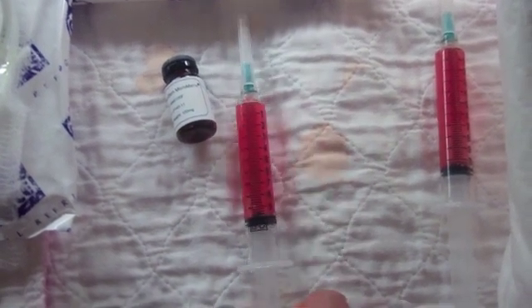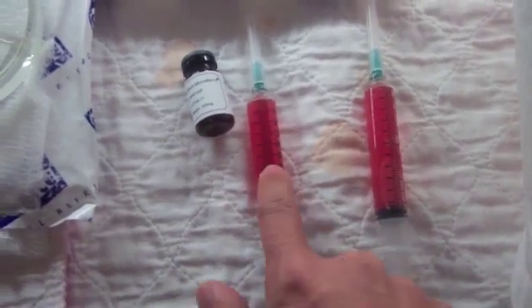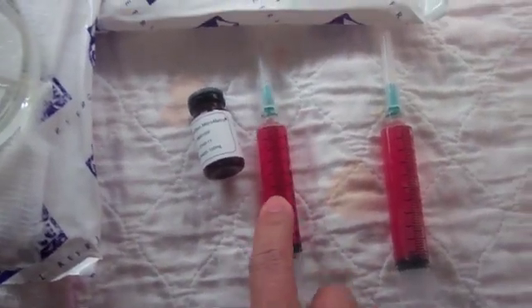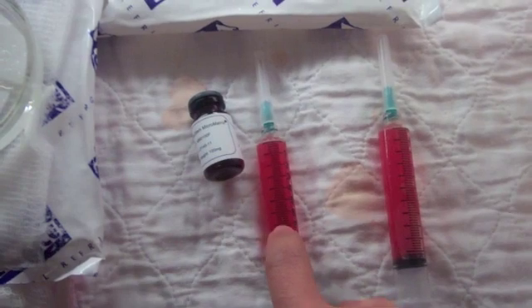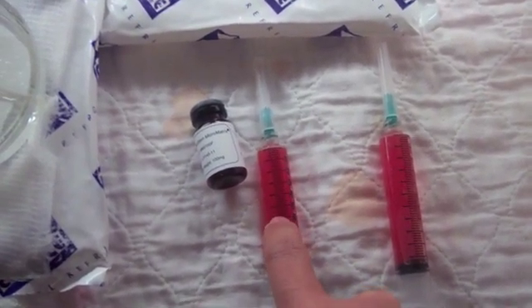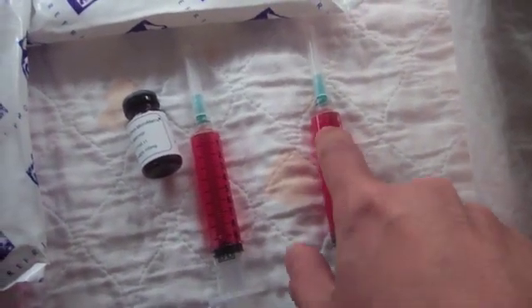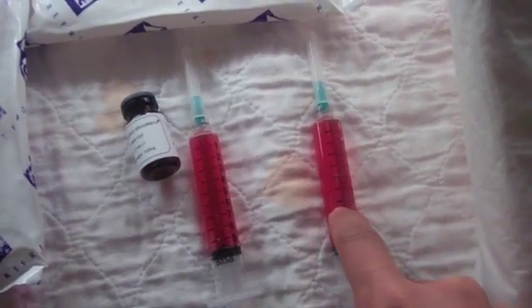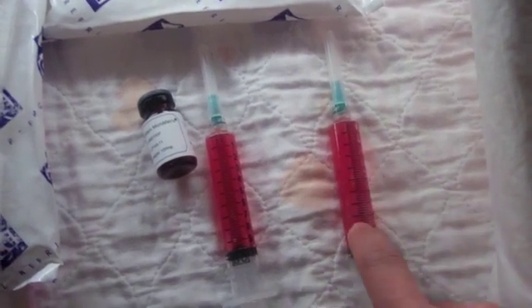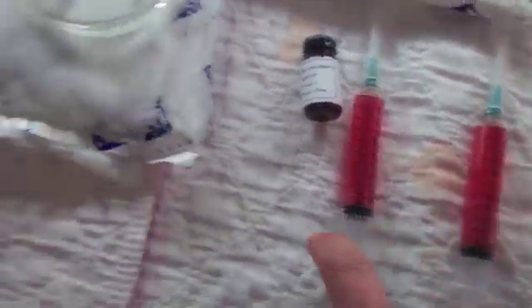Our team is excellent, but it's taken things to another level. These are the ones mixed with A-cell we're going to be using with the grafts. A lot of people ask what kind of storage medium we use — saline or hypothermosol — and we really believe having your own purified blood with the growth factors and A-cell has been amazing as a graft storage medium. This is going into the recipient bed, the area of the crown where we're putting the transplants, acting almost like a fertilizer to help hairs grow tremendously well.